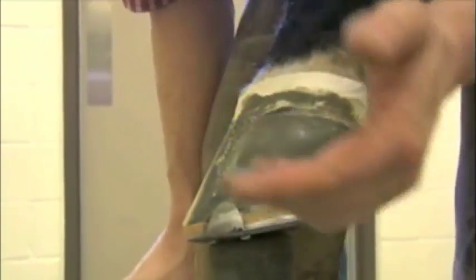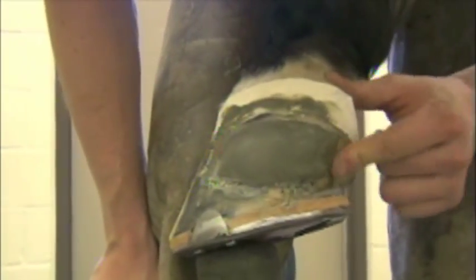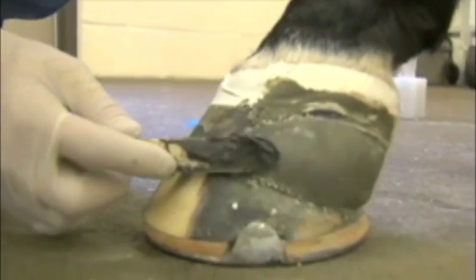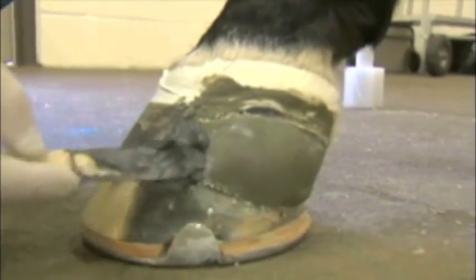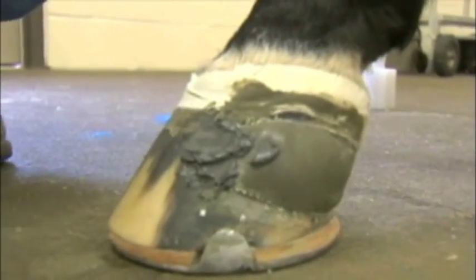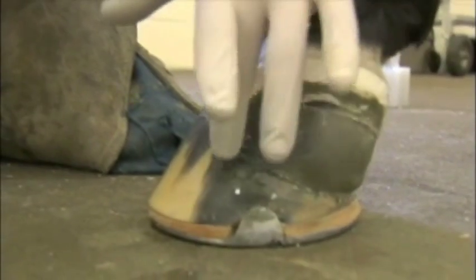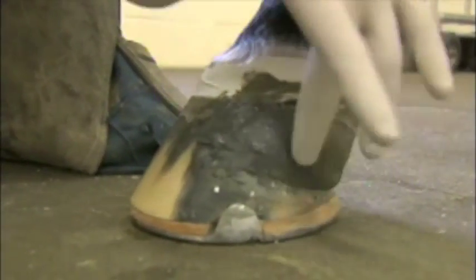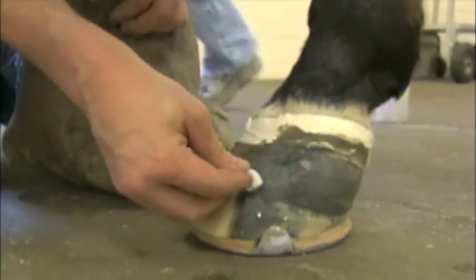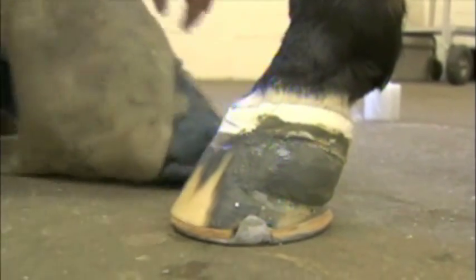Let me take a one-ounce jar of Equilox and just clean up this edge here — it's a little rough. I like to see it a little smoother, like how it is back by the heel. I like to keep it low. Once it starts getting tacky, I'll just wrap it to make it look smoother.